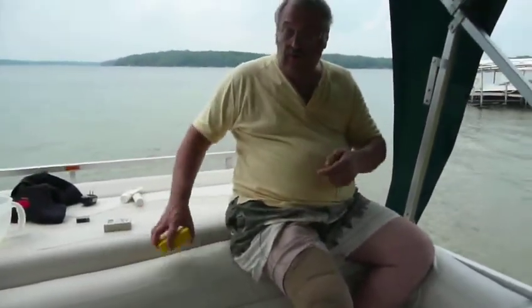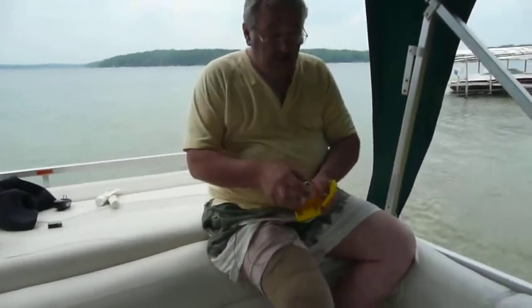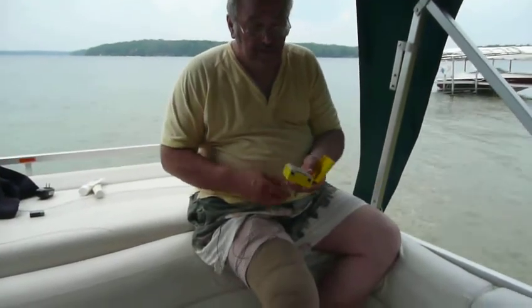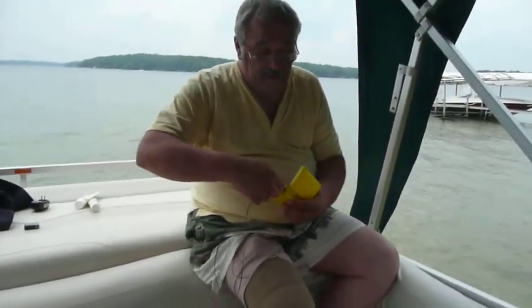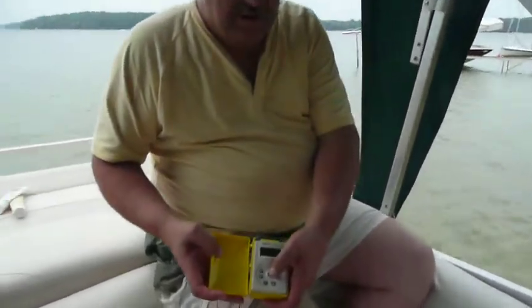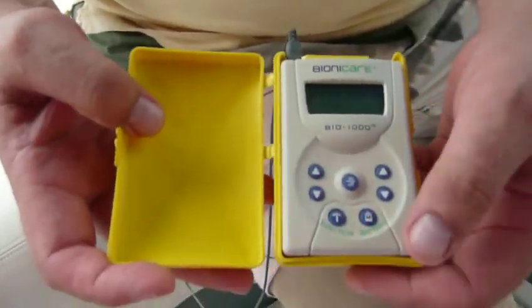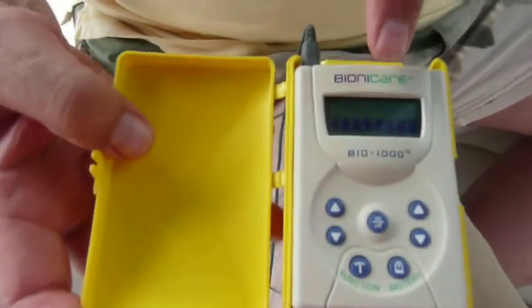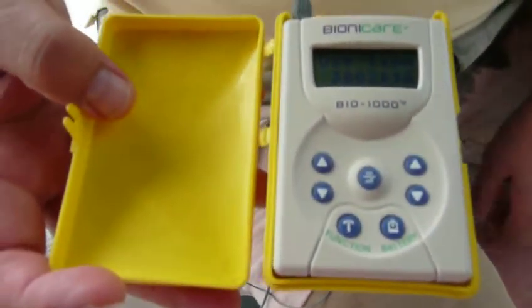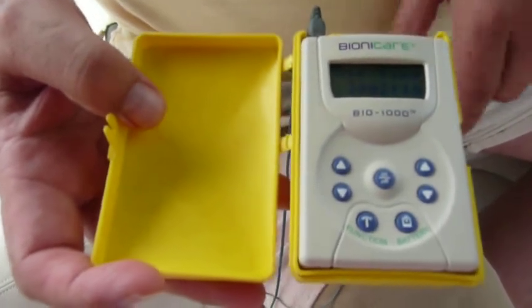With your Bionicare unit, I came up with using this soap dish — I'll try to explain that later if I have time. I turn the unit on — this is your on button there. I can tell how much battery life I have left; this is a full battery. I can tell how long I've been using this, how many hours I've put into it: 3,002 hours and 16 minutes. That's over the span — I started using this back at the end of 2003.